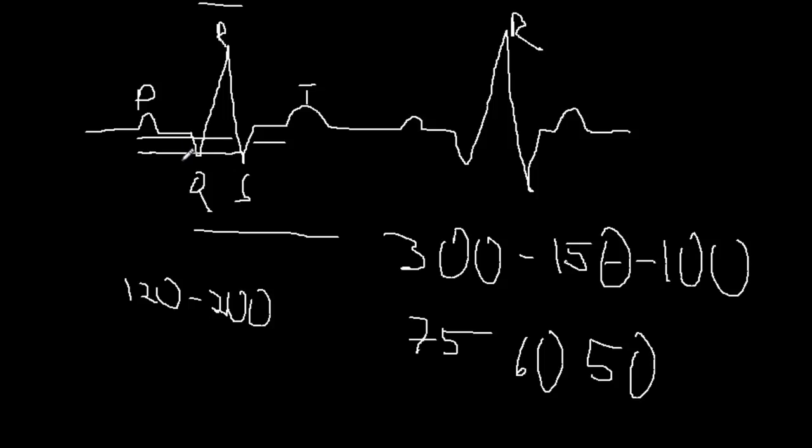If you see someone with second degree heart block, there are 2 kinds. Basically, second degree heart block is when one or more atrial impulses, an impulse that starts from the atrium, doesn't make it to the ventricles. And there are 2 ways that happens. So type 1, which you might hear called Wenckebach, is where the PR interval continues to get longer and longer until there's a drop beat.